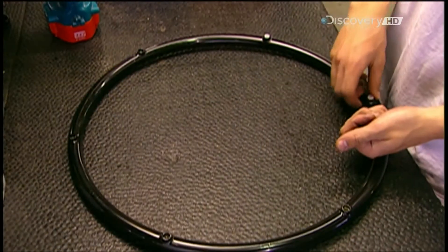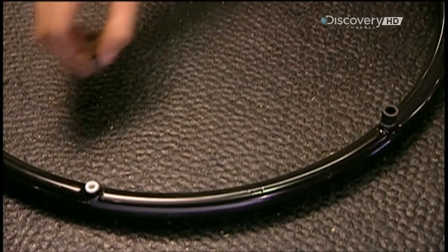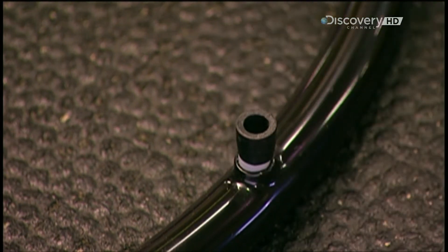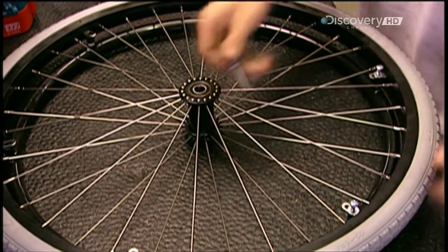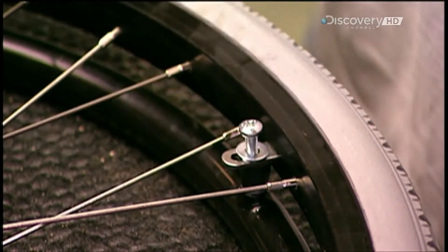Workers install twelve washers, called spacers, along the hand rim. Six of these one centimetre spacers can be removed later to adjust the chair's overall width if necessary. The spacers on the hand rim align with the brackets on the wheel.